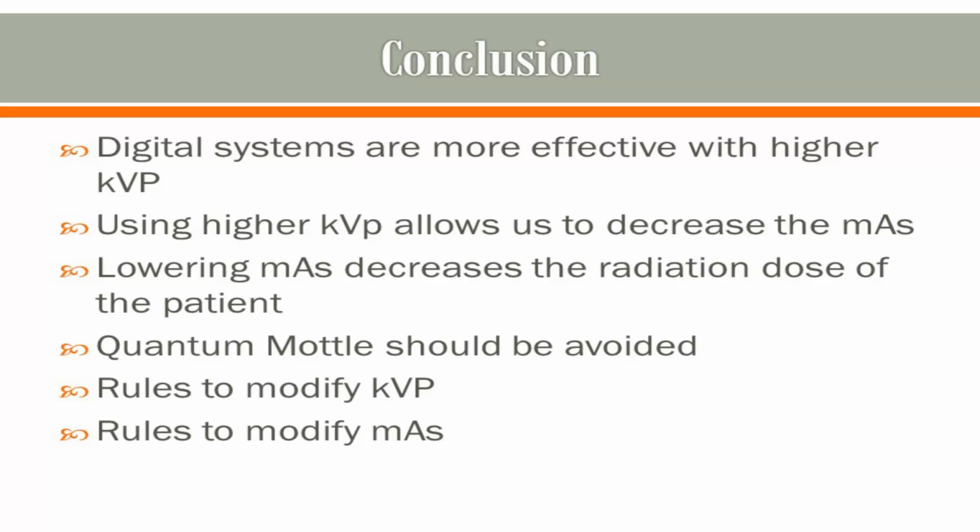We also need to know the rules to modify kVp and mAs like the back of our hand. This should eventually become second nature to us so that we can make good, quick decisions on the floor based on the calculations we've made in our head.